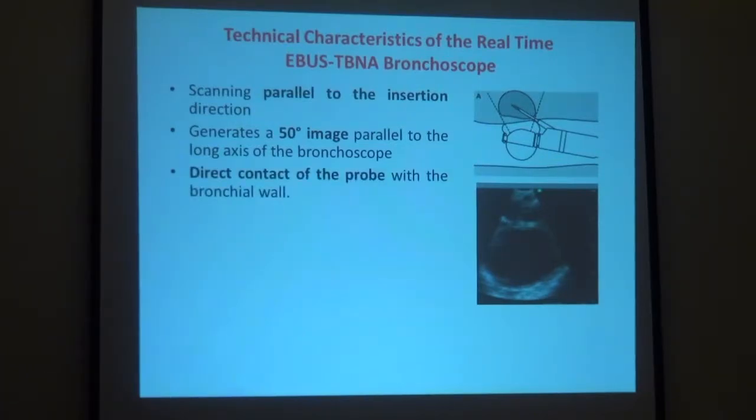الدايركت لازم يبقى فيه دايركت كونتاكت مع البرونكيال وول، لازم تلزق المنظار في البرونكيال وول. لو في حتة مش لازقة هتلاقي أرتيفاكتس، وهيوريها لكم الدكتور حسن أكيد في البرايم شوتنج، فمهم جدا تلزق، خصوصا لو بتطلع الكاثيتر. ساعات وإنت بتطلع الكاثيتر تلاقي شوية أرتيفاكتس لأن المنظار بيرجع منك شوية لورا، فتقوم تزق المنظار تاني عشان ما تحصلش الأرتيفاكتس، لأن أهم حاجة إنك تعمل دايركت كونتاكت.